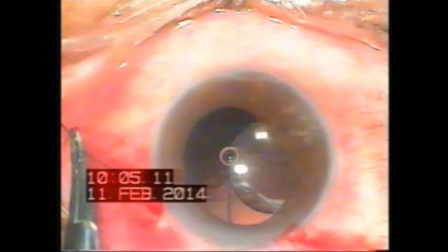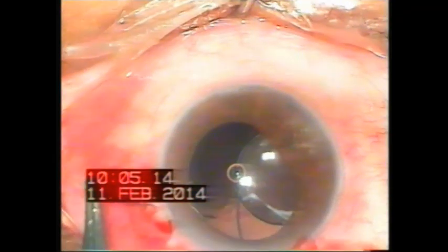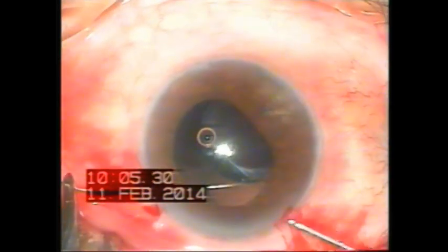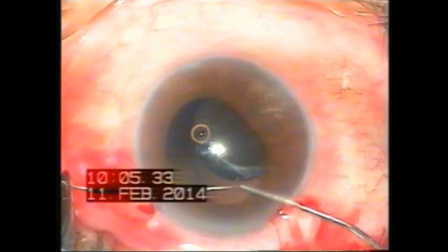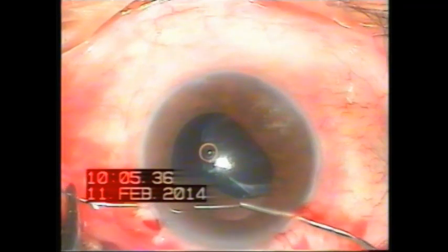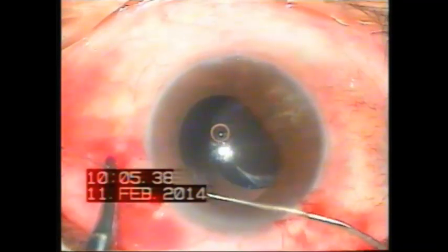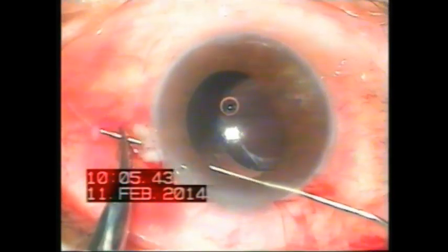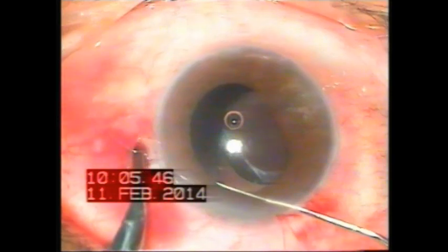27 gauge bent needle and 10-0 proline straight needles were used for this purpose, applying railroad technique, encasing the IOL haptic. Suture needle was retrieved at opposite limbal paracentesis using viscocannula as a guide.